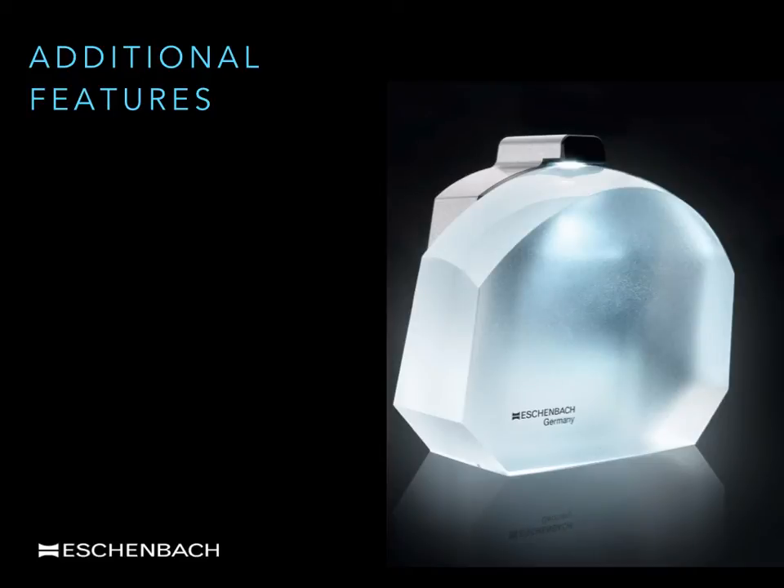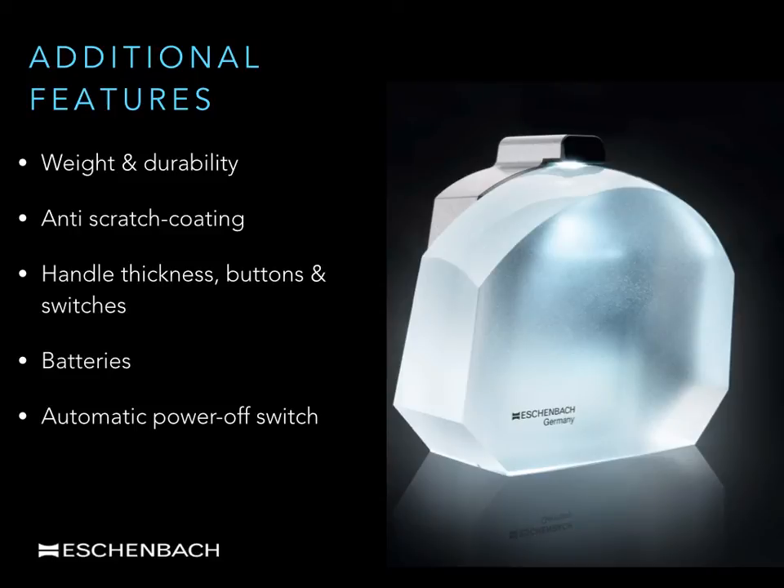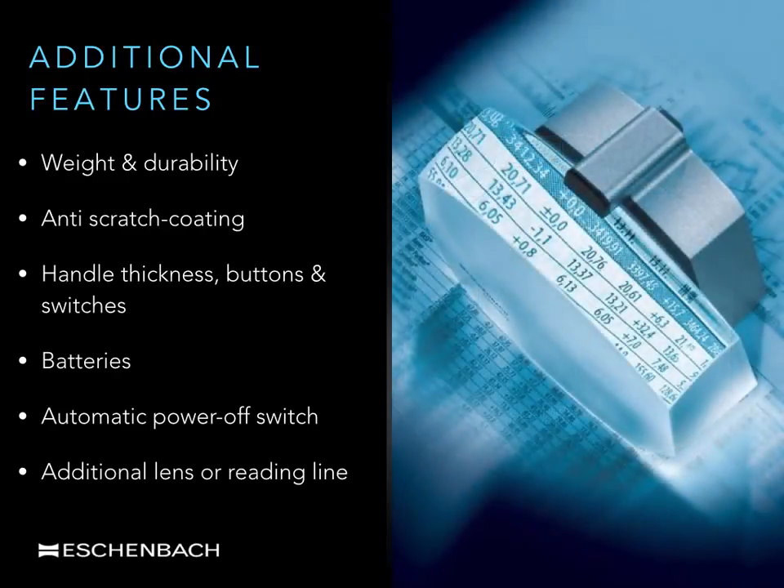Additional features such as weight and durability, anti-scratch coatings, handle design and thickness, buttons and switches, and the ease of changing batteries are just as important with stand magnifiers as they are with hand magnifiers. Several stand magnifier designs incorporate a power-off switch, automatically switching the device off after 30 minutes if not in use. Several magnifiers in the System Vario range have an additional retractable lens with increased magnification or an additional reading line or measuring graticule. And in the Macrolux, the edges of the lens are cut away so that the lens can fit into the spine of a book or a telephone directory.